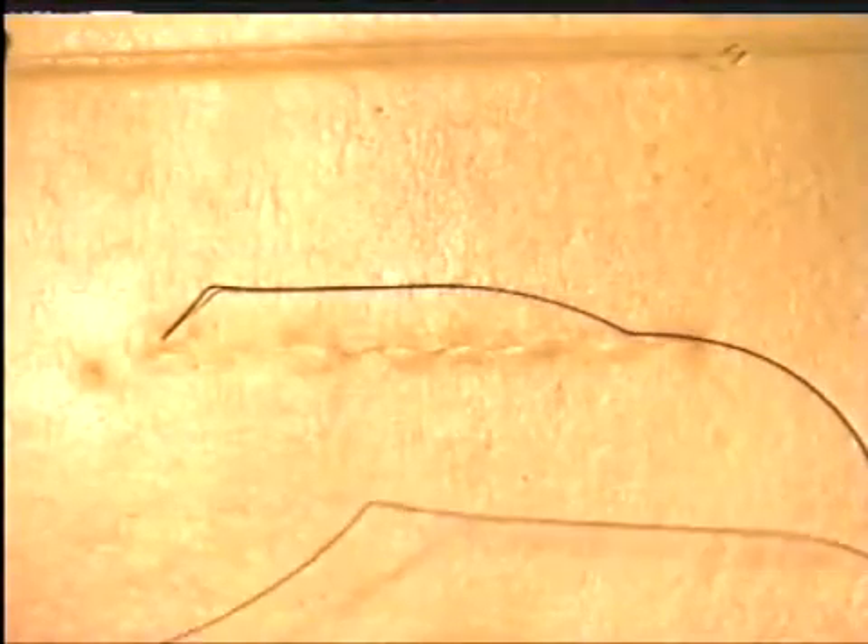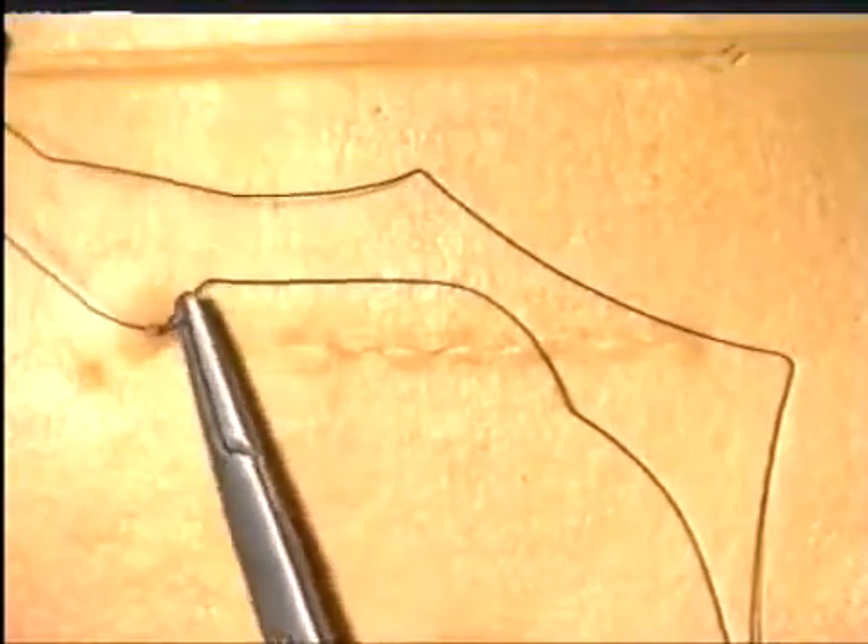At the end of the incision, the needle can be exited about a centimetre away from the edge, and then the needle reversed and passed back almost through the same hole in the skin in the opposite direction. This can be repeated, passing the needle through the same skin hole, back again and then cut.